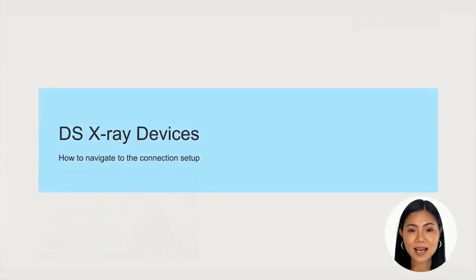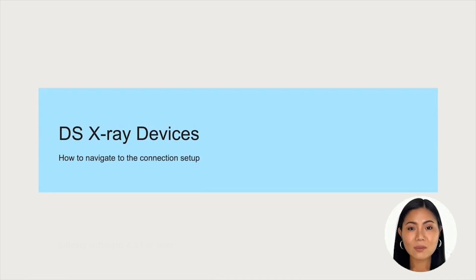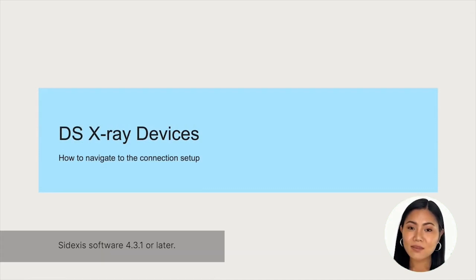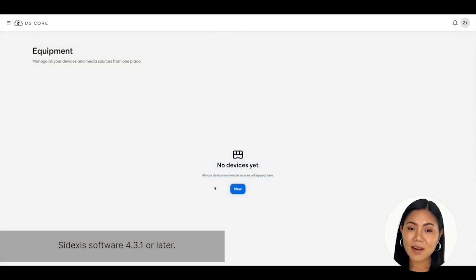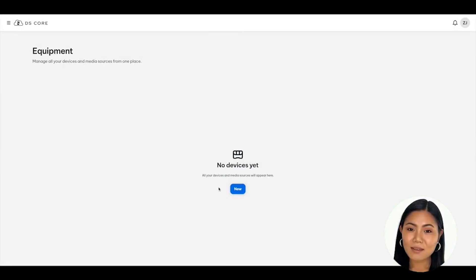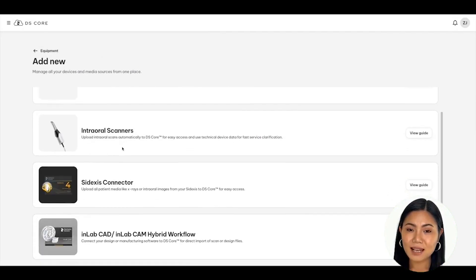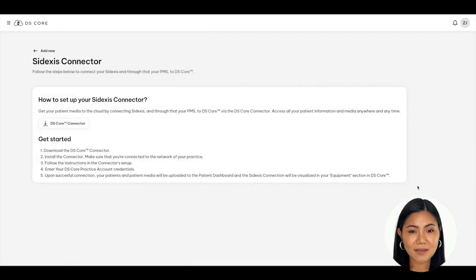To connect your Dentsply Sirona X-ray devices to DSCore, you'll need to install the Cydexis connector. Open a web browser on a computer running Cydexis software 4.3.1 or later and log in to DSCore. Navigate to your equipment list, click the new blue button, and then click on the white View Guide button located in the Cydexis connector section to begin. A set of instructions will appear on how to start connecting your Cydexis software to DSCore.